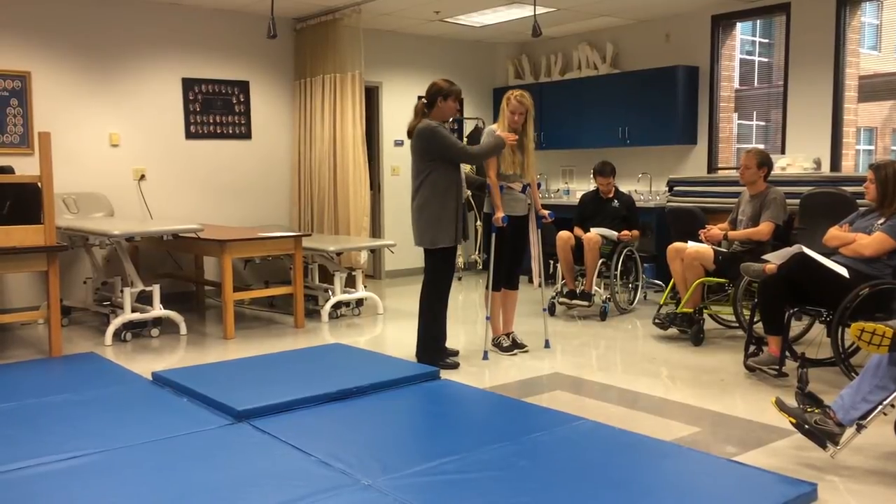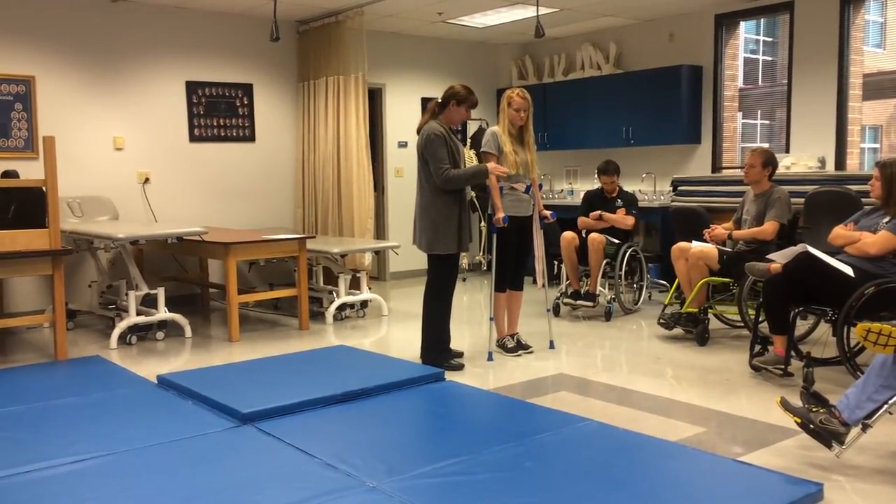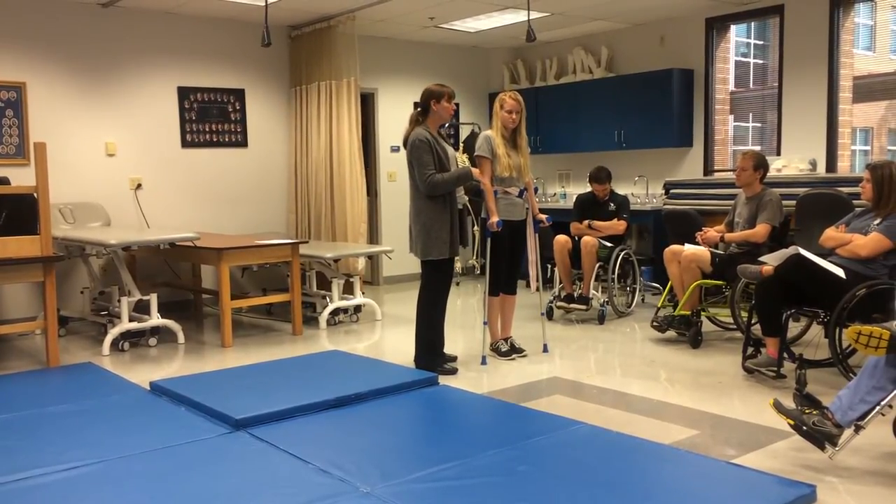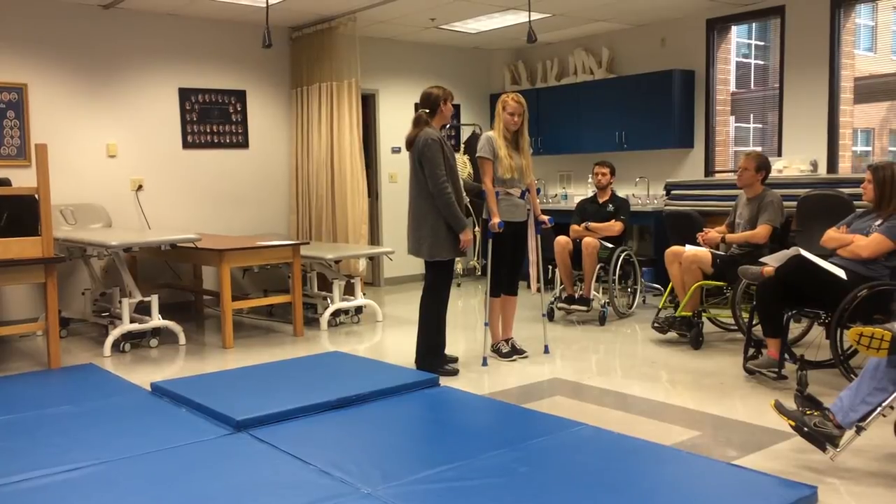So you would guard your patient here and work on swing-to gait. Swing-to gait is a lot safer on the shoulders than a swing-through gait. Swing-through gait, of course, is faster.